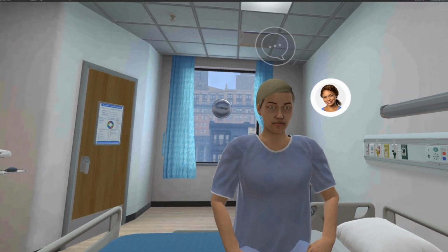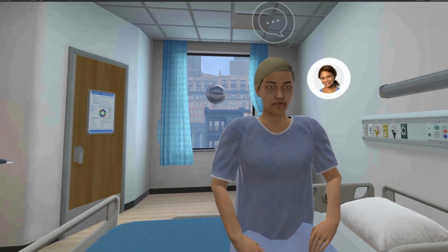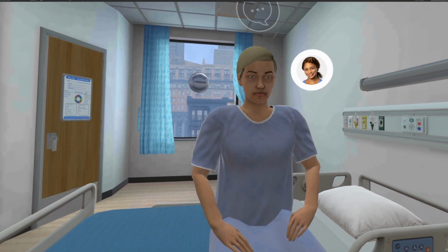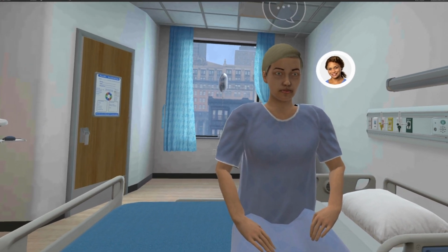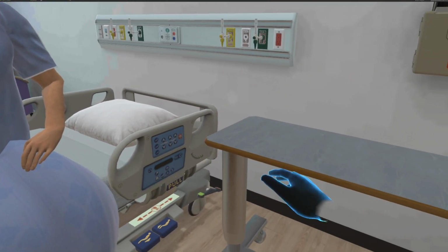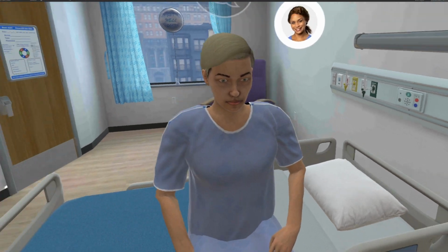Hi there. I need your help taking a patient's temperature. This is Carla. I confirmed her identity and explained the procedure, and she gave consent for us to continue. Always follow established safety, hygiene, and infection prevention policies and procedures.